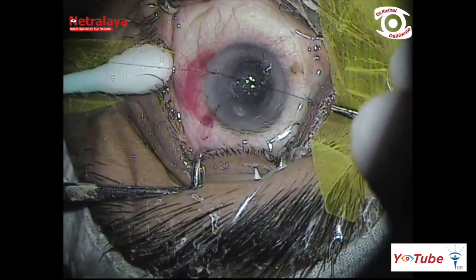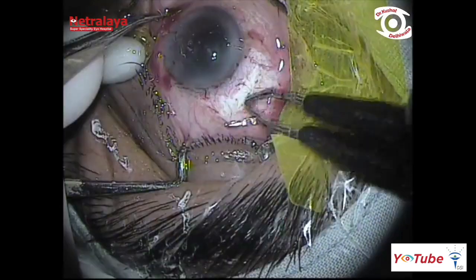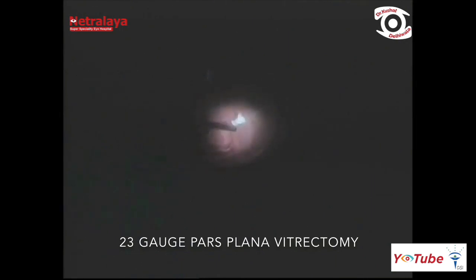After securing the temporal corneal wound and performing conjunctival peritomy in the supranasal quadrant, a 3-port 23-gauge pars plana vitrectomy was performed.